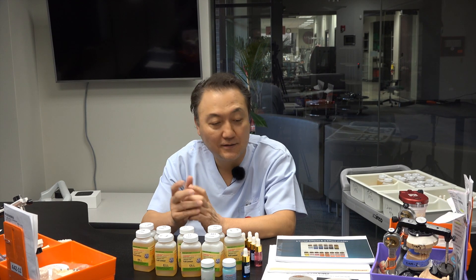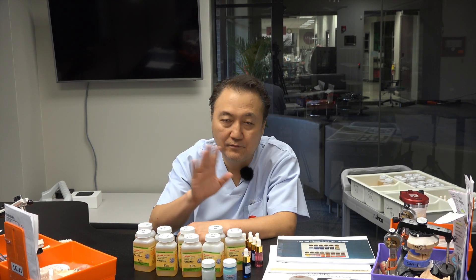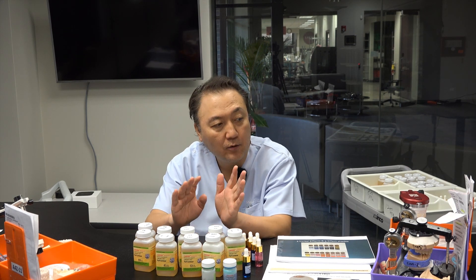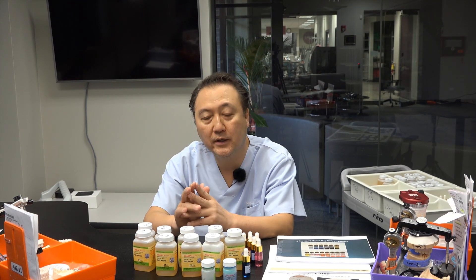Hi, this is Luke. I would like to talk today about pre-shading color for full mouth zirconia, whether single crown, and the frame design for zirconia pre-shading.